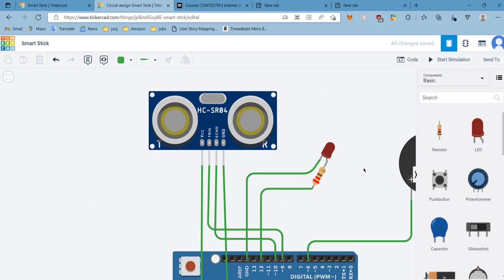You can see the trigger pin and echo pin there. How it works is first of all the ultrasonic sensor sends an echo to the object and then it gets reflected back to the ultrasonic sensor.